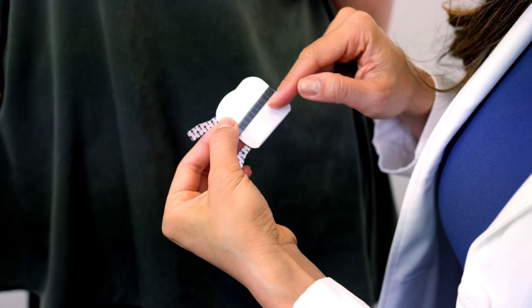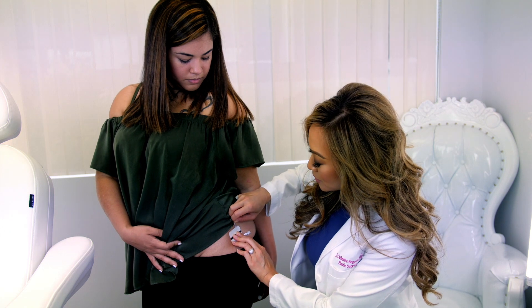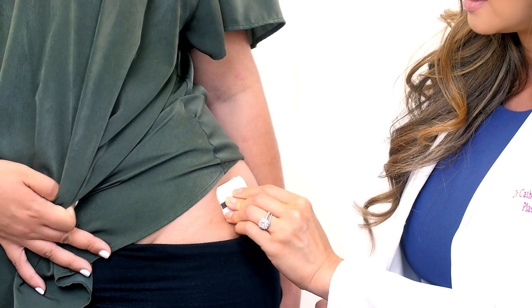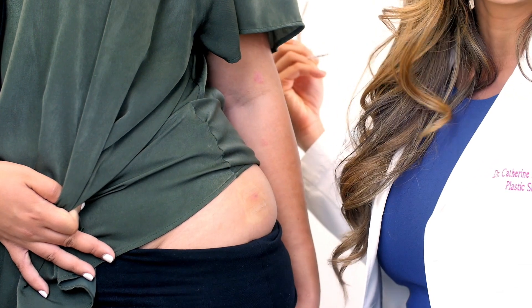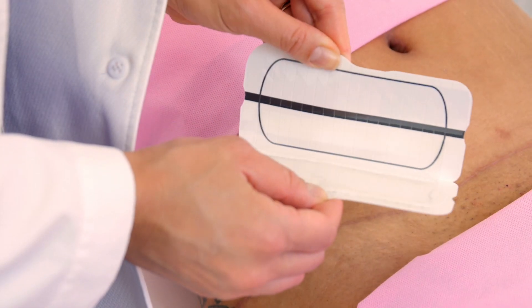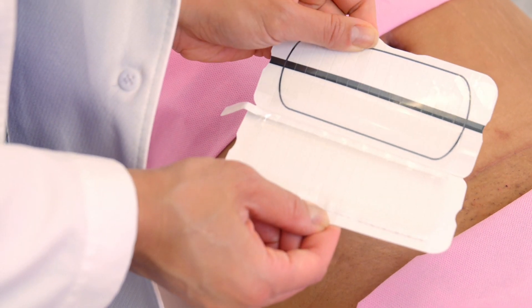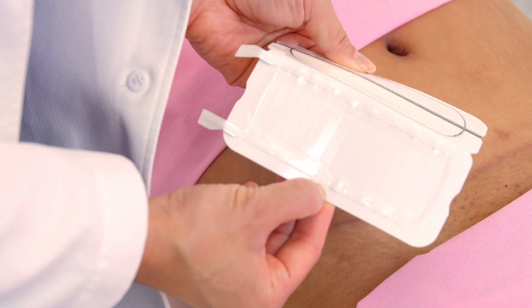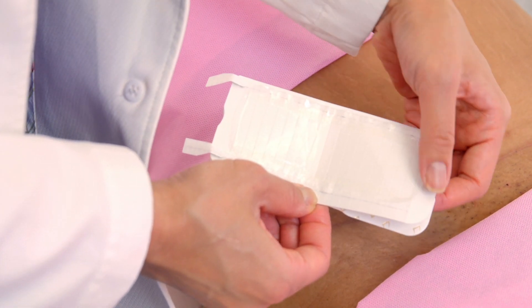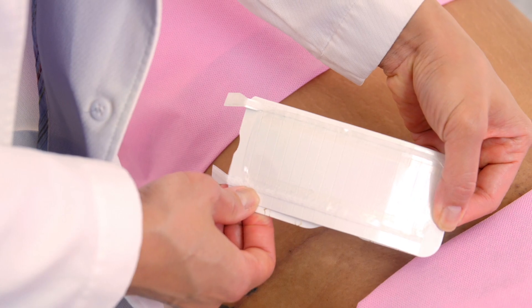Secondly, the stress shield technology stabilizes and protects the scar from clothing and everyday movement. As you see here, when you open the applicator and turn it inside out, it puts stretch on the silicone sheet, so when you release it, it reduces tension on the incision.